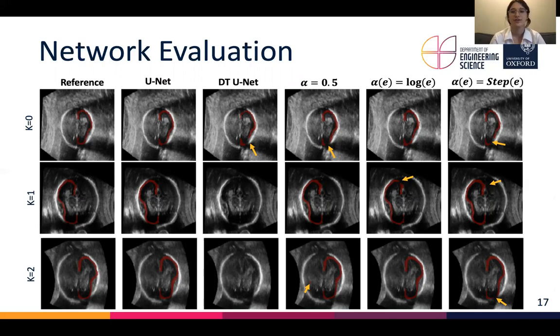And this was due to the fact that we threshold the regression task to get the cortex, but on 3 out of the 5 k-folds, it just wasn't learning depth well enough. So thresholding it just produced nothing because it was predicting distances which were way off the correct value, which suggests the task was too difficult for this simple network.